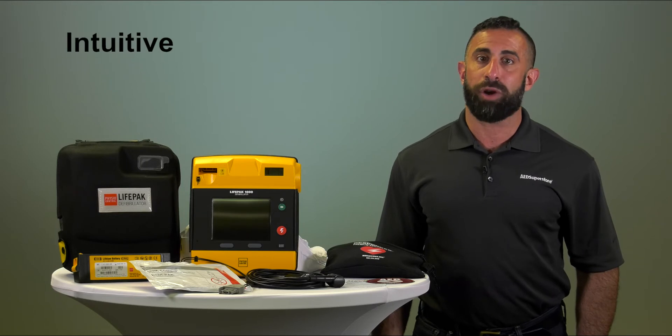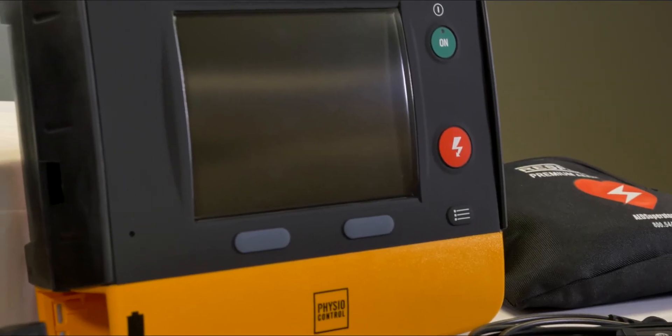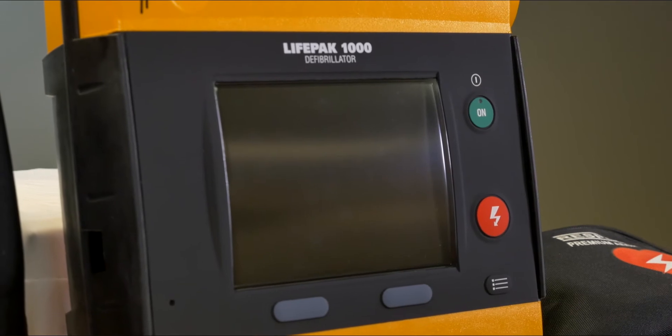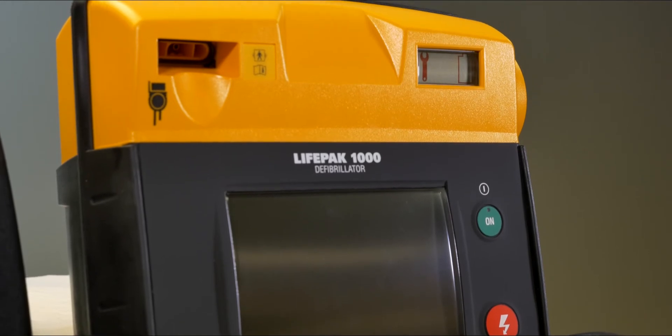The LifePak 1000 is incredibly intuitive. The battery gauge is easily visible and accessible, and a large screen displays graphics and ECG readings. Emergency settings can be chaotic and noisy, so the LifePak 1000 has loud voice prompts for rescue guidance so you never miss a step.